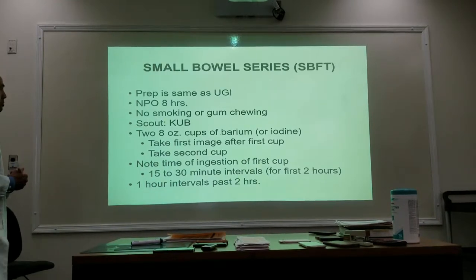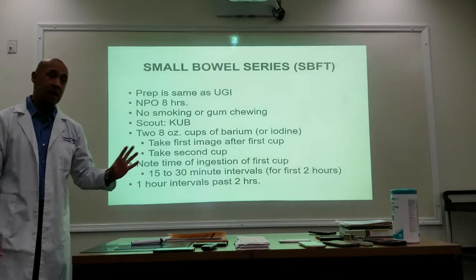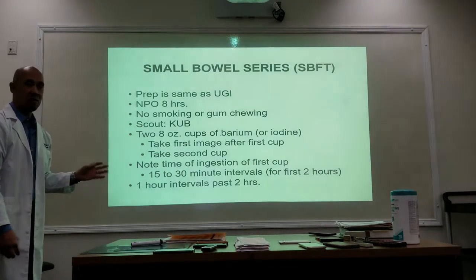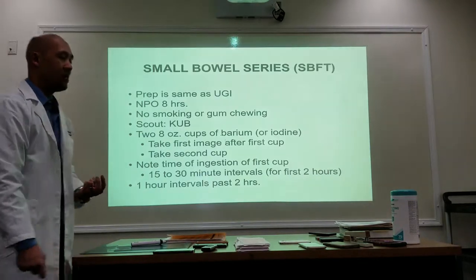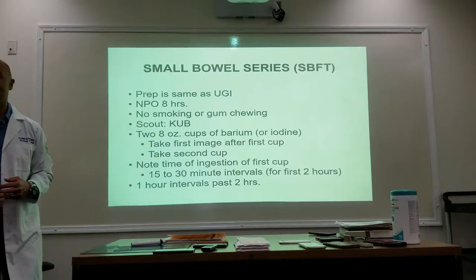And before you begin the procedure, you want to make sure you have 2 8-ounce cups ready of barium or maybe iodine. Again, we've got to figure out, are they indicated to use barium or are they contraindicated? If they're contraindicated, then we have to use iodine. The problem with iodine is that visually it's very, very difficult to see under x-rays, but it's better than nothing.